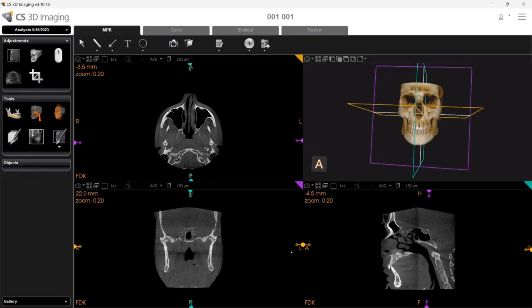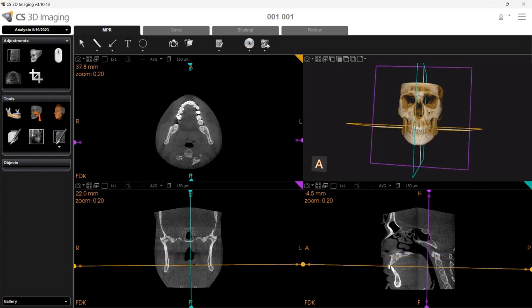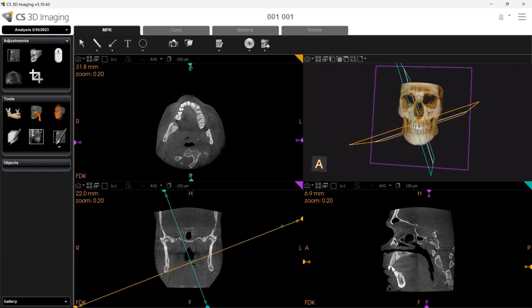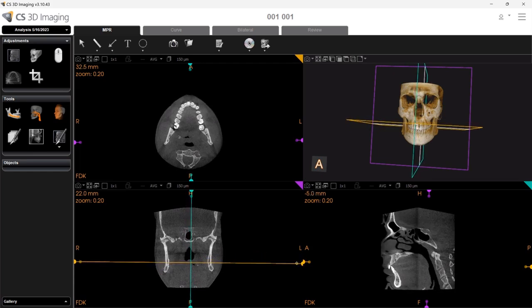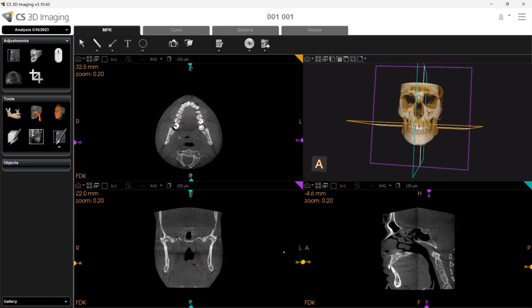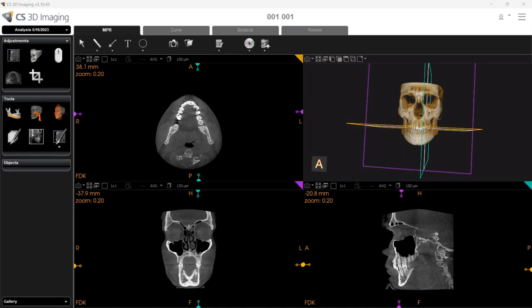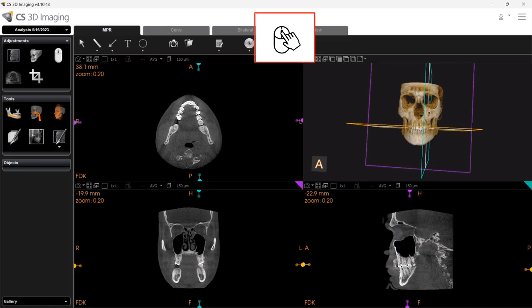For example, to adjust the axial view, left-click and hold on the large round yellow handle to move through the axial slices. Or, left-click and hold the small round yellow handle to tilt the angle, which allows you to align the plane with any anatomical features in the 3D volume. During manipulation of a view, you may want all views to intersect at the same point again. To do this, simply hover over the view screen and push down on the wheel of your mouse to perform a wheel click, and all views will move to intersect at the same point.